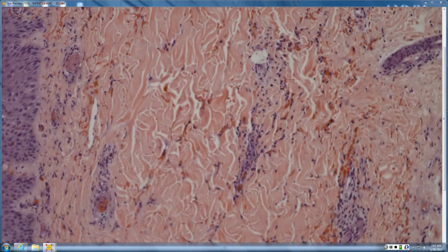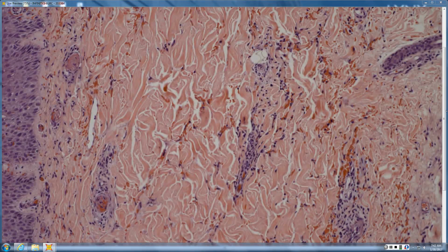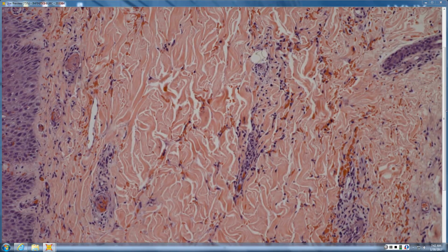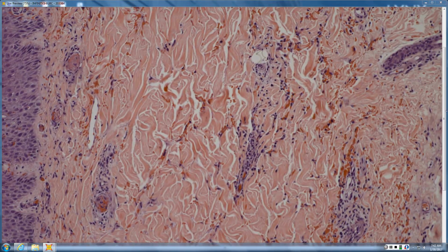Clues to gonococcemia: arthritis, septic joint, acral hemorrhagic pustule, usually a palmar or dorsum or side of the finger hemorrhagic pustule, would be classic for gonococcemia. So both the pathology and the site were helpful.